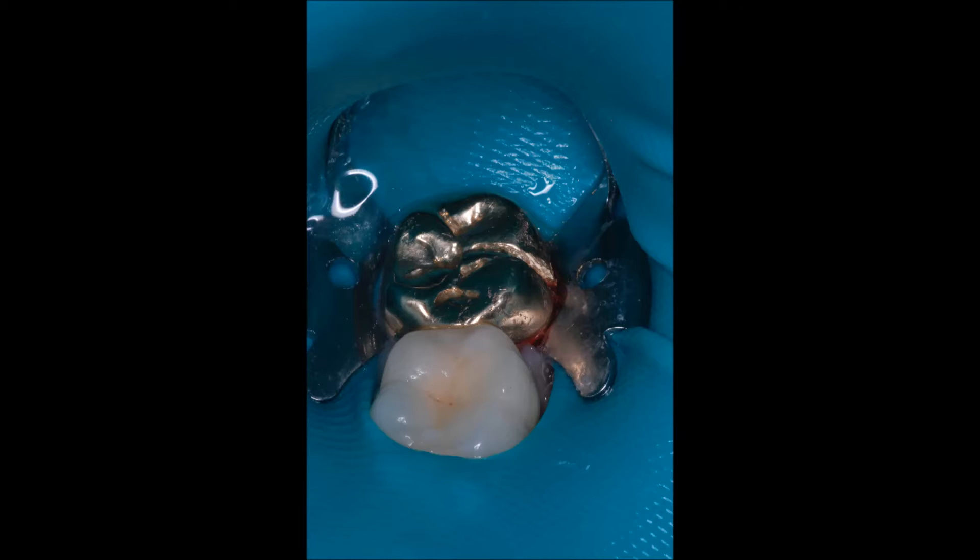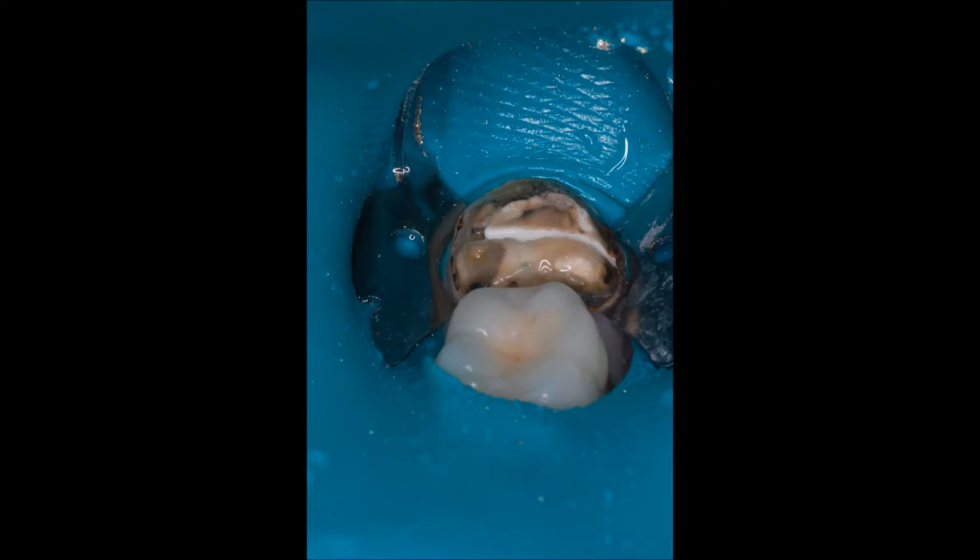The rubber dam is an excellent tool for removing old crowns. Quick and easy to place — you are only isolating one tooth, so there is no need to floss the contacts. Clamp it and go. As you can see, it is easy to visualize your buccal to lingual slice.